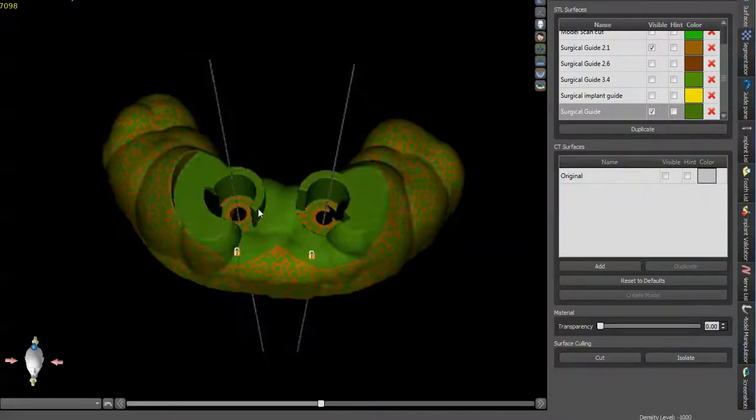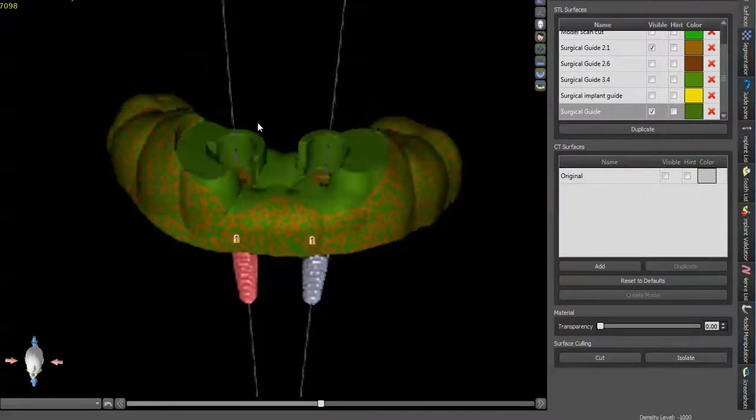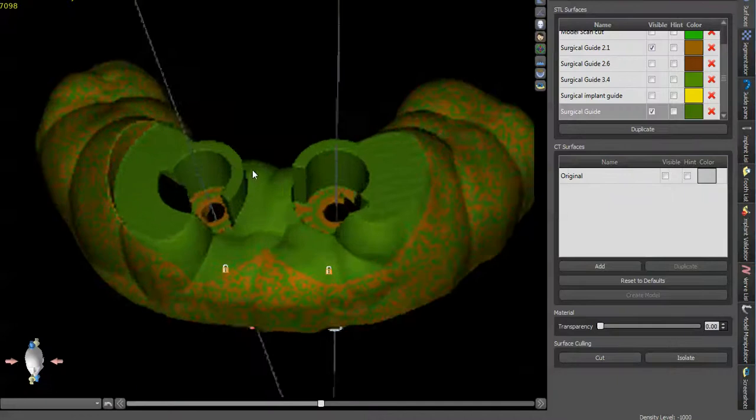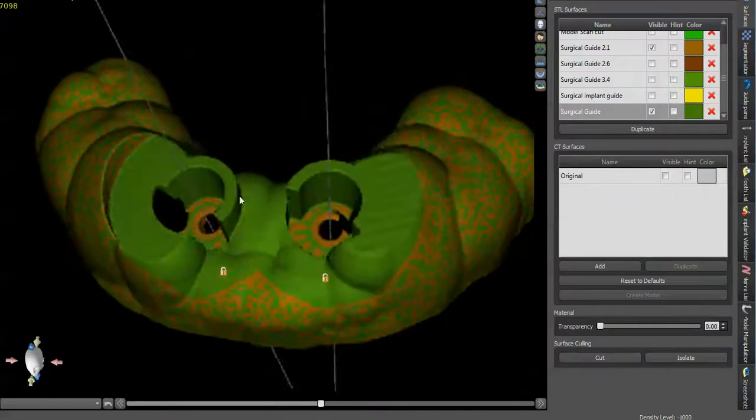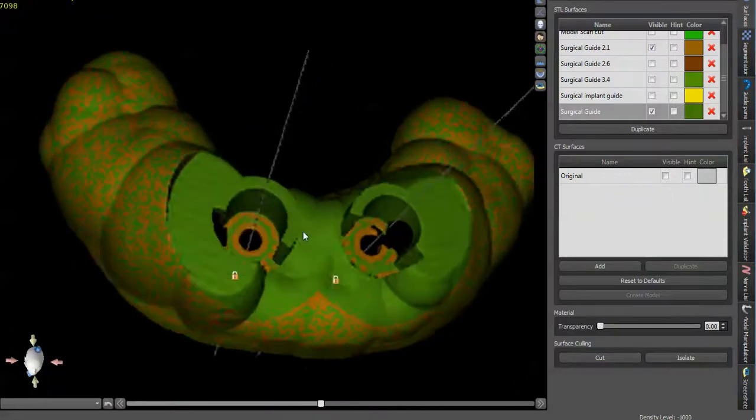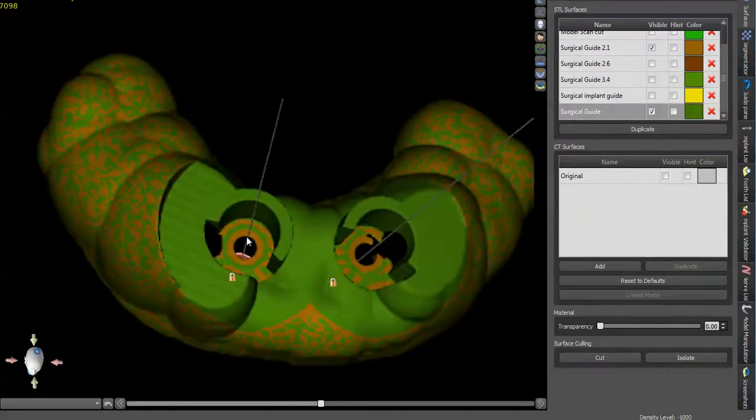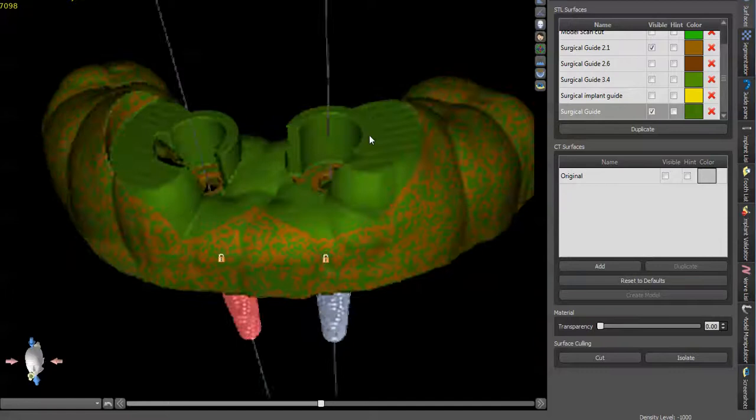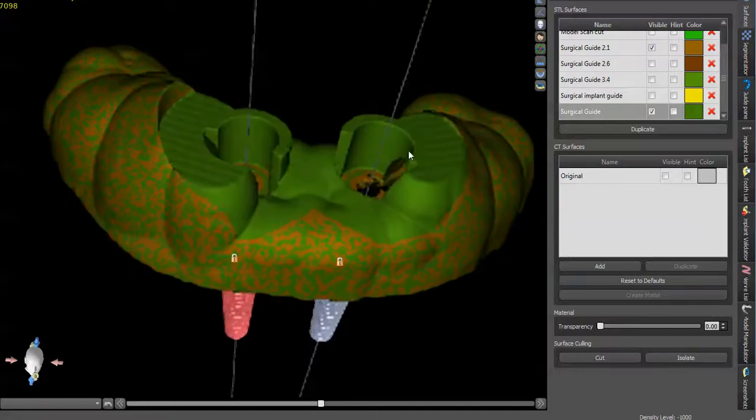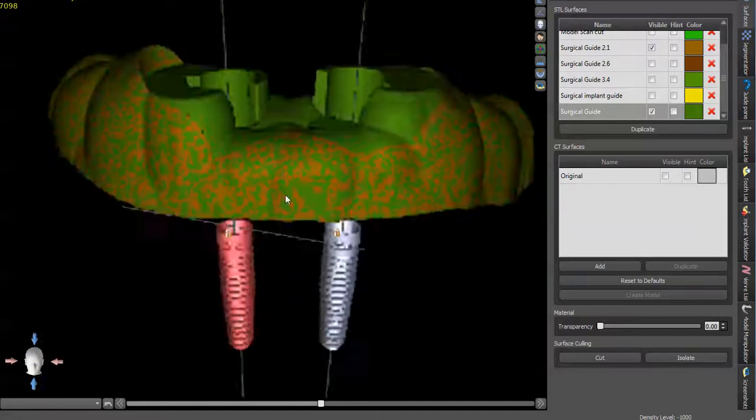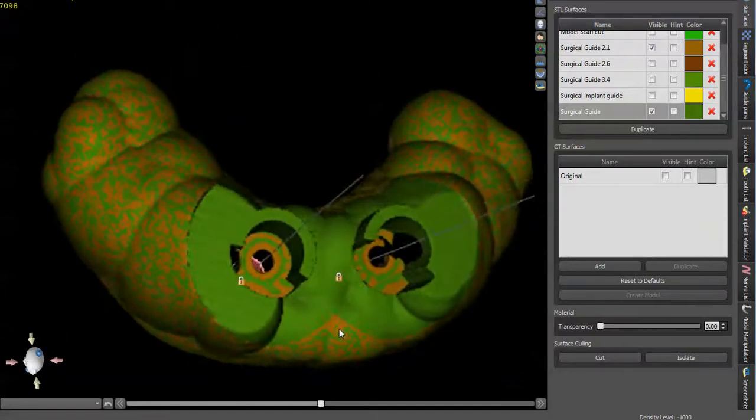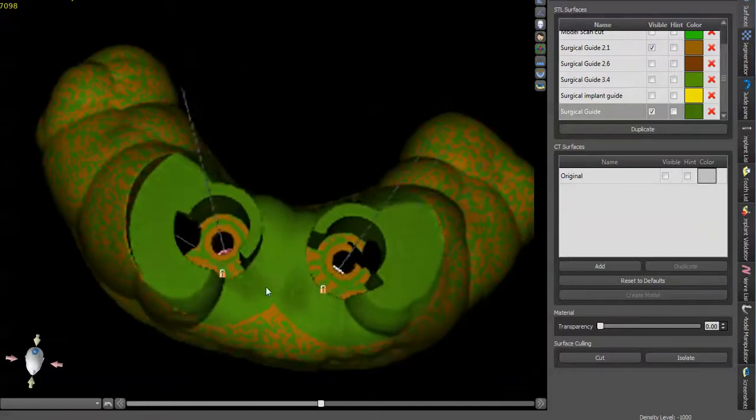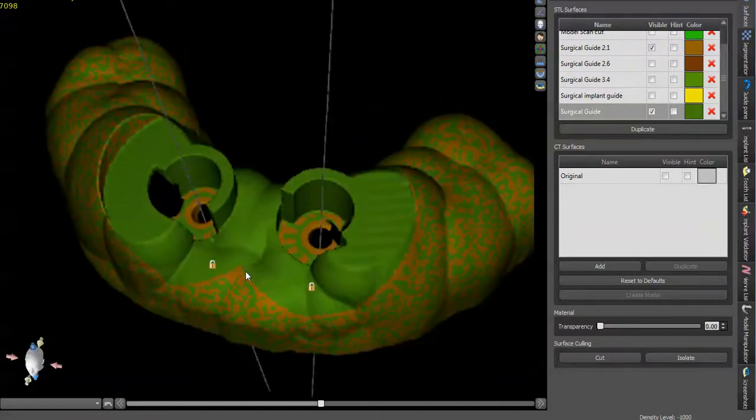So you can see how it's flat across. If I'm using this where I have a little bit more with a guide sleeve tube in here, I have less room for slop when my drill goes in. And it's a little bit more accurate.